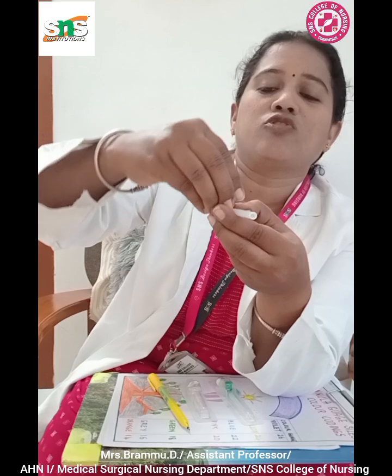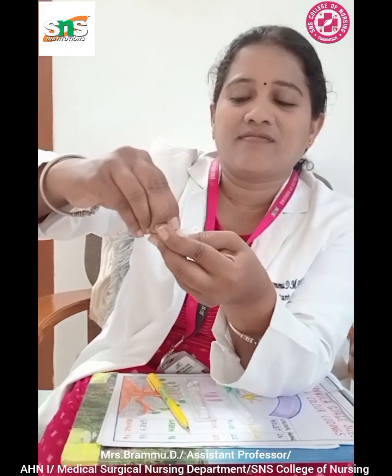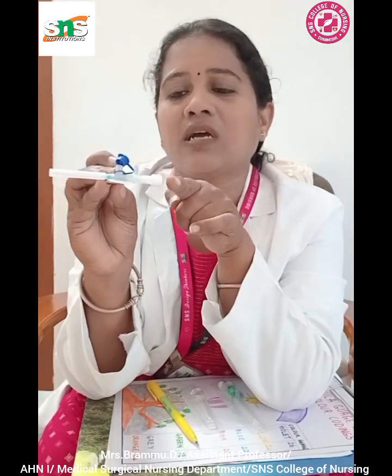So next we can see the injection port, which is very anteriorly placed, next to the wing or near the hub, which is the other port on top. You can see we will be using this port when the patient is fixed with the IV cannula. This is a dedicated site for administering additional medications or fluids without disturbing the primary IV line.